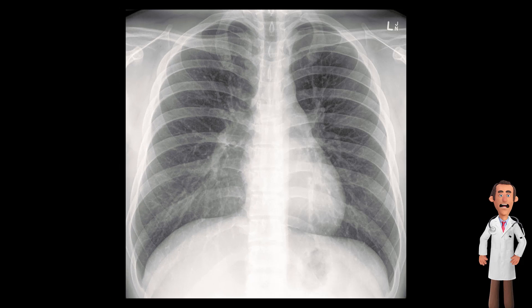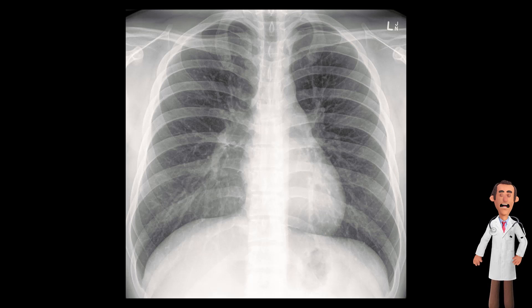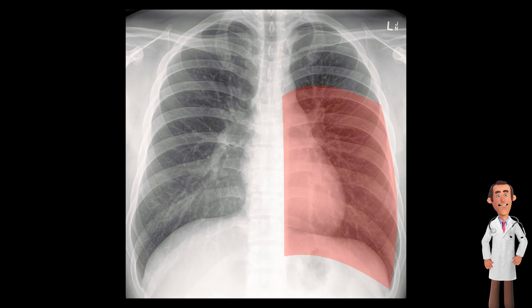Moving on to the left side, the left lung is divided into two lobes, also by an oblique fissure. Here is the left upper lobe, which appears to occupy the entire lung field and touches the left heart border. The left lower lobe is similar to the right and shares a border with the left hemidiaphragm.